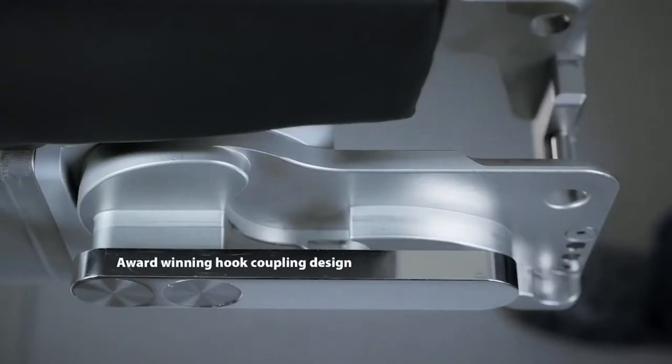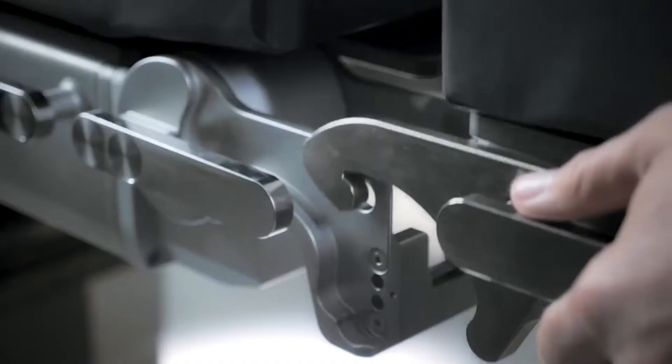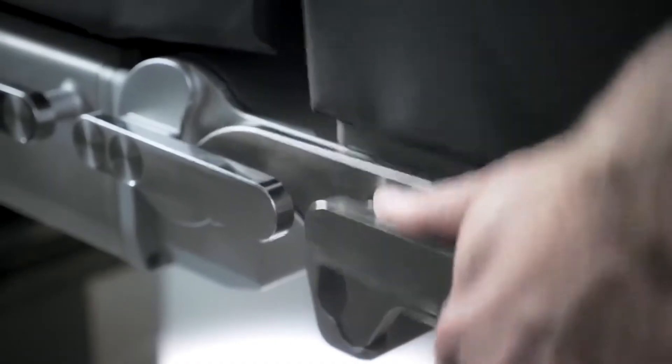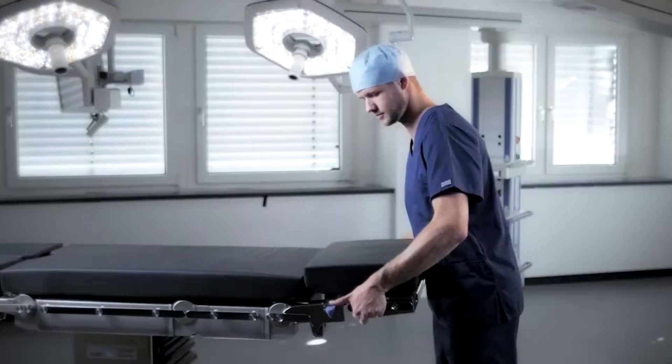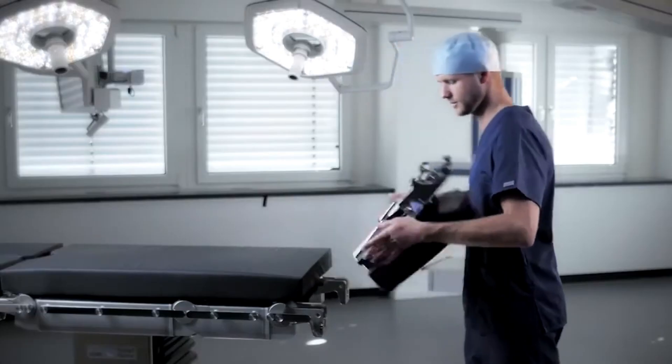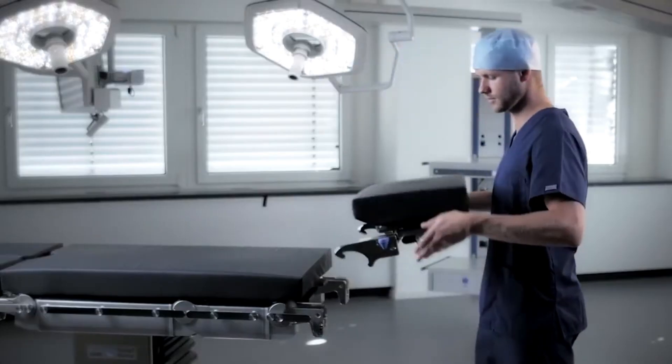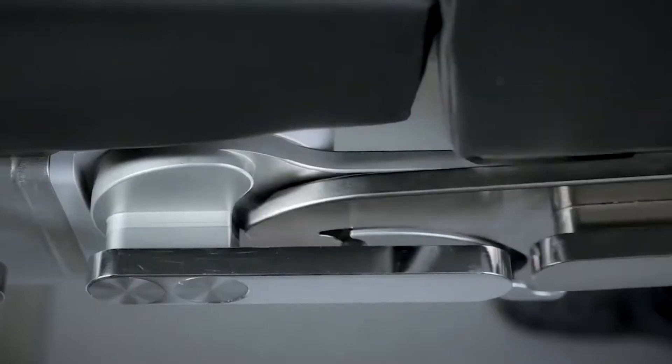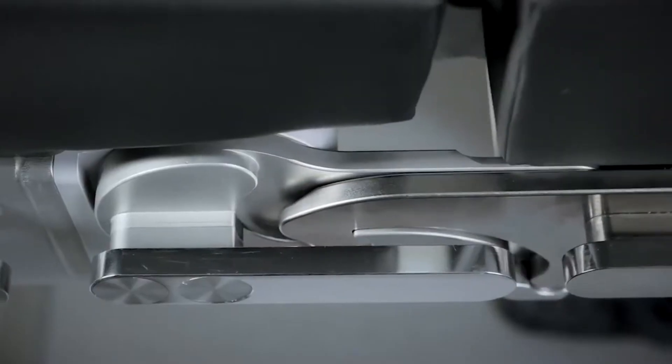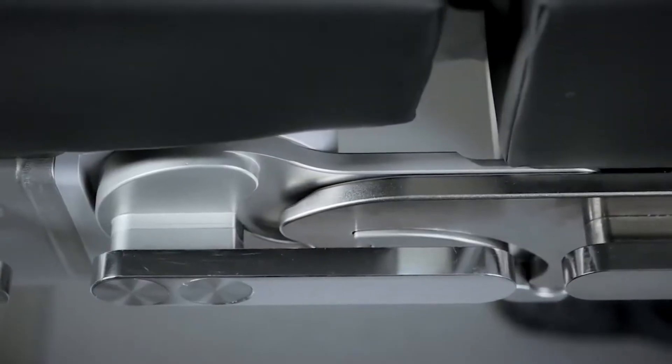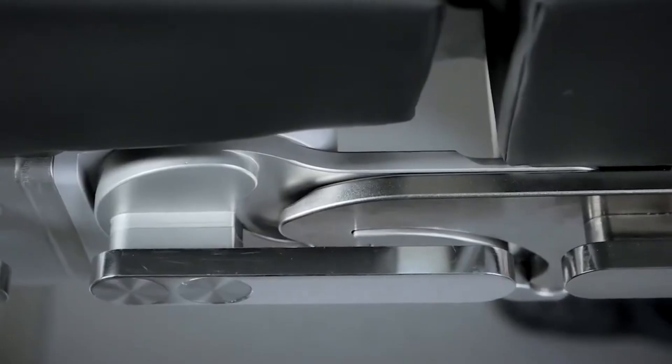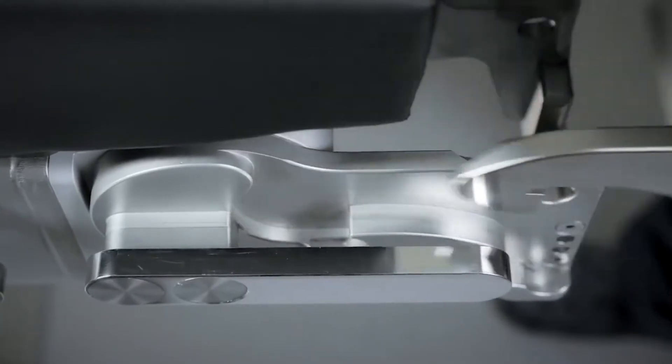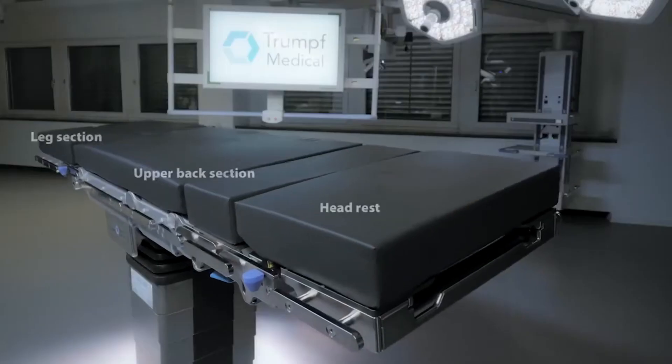A wide range of additional components attach to the table to support the patient, including arm boards, headrests, leg supports or stirrups, anesthesia screens, and instrument trays.